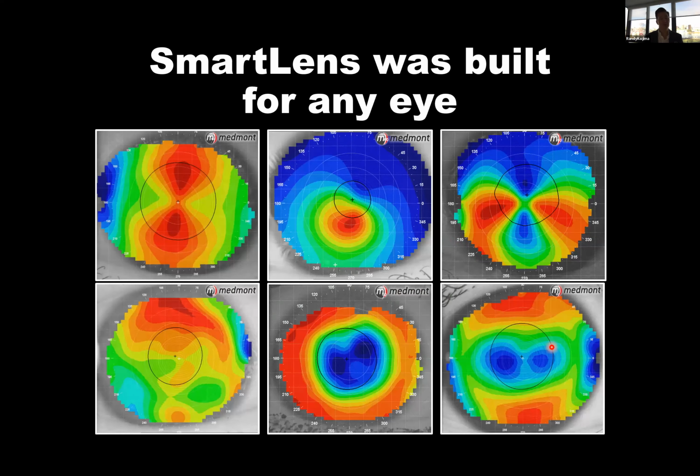So regardless of the eye shape, whether it's slightly astigmatic or normal in shape, and we have ocular surface disease, then we can fit the scleral lens on that eye. If we have an absolutely asymmetric keratoconic, we can use the healthy scleral shape to our advantage, create an even distribution across the eye surface, and virtually anything in between.